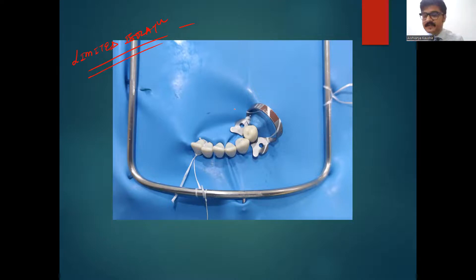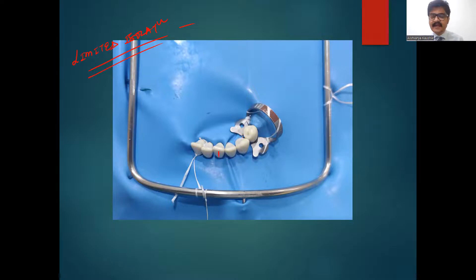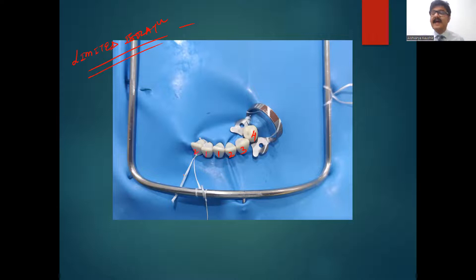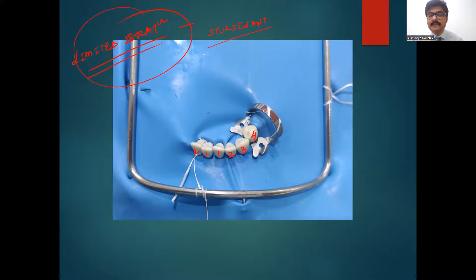Let us look at this classic example. I'm performing restorative procedures on the central incisor of the third quadrant, lateral, and canine. According to limited isolation, I would isolate at least one tooth posterior — that's my first premolar, number four — and two teeth anterior to the tooth being operated on — that's the fourth quadrant central and lateral. So this is satisfactory, according to the limited isolation guidelines from Sturdevant.